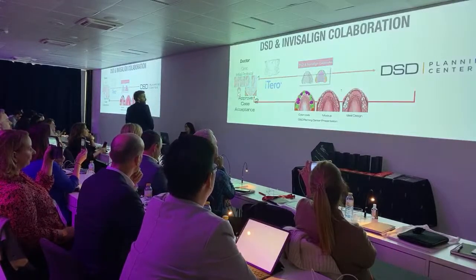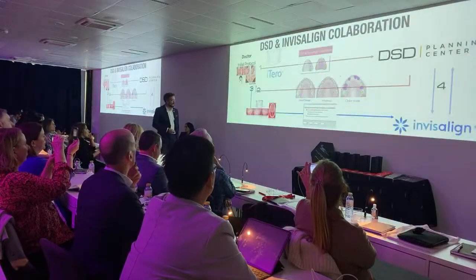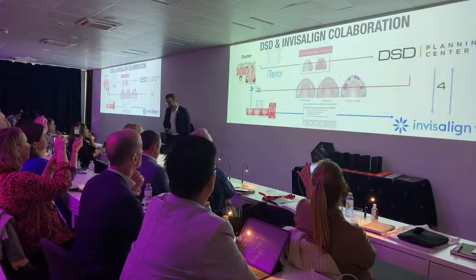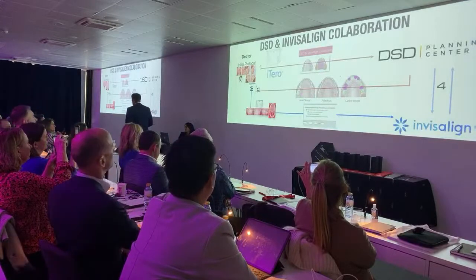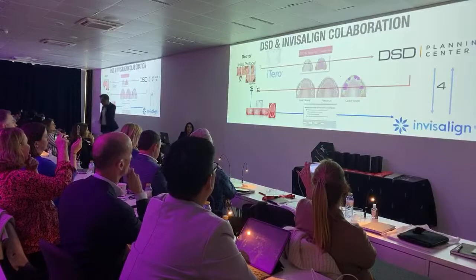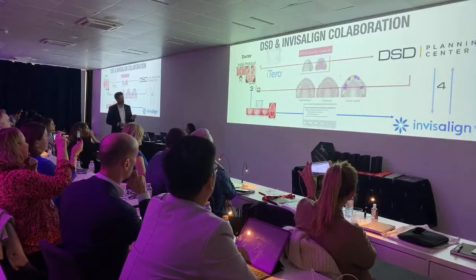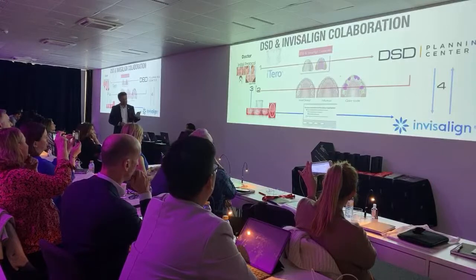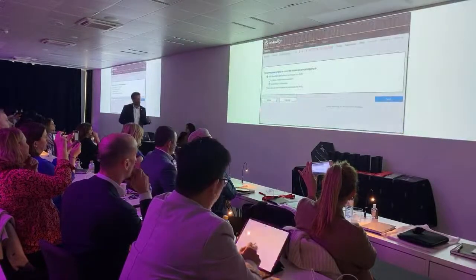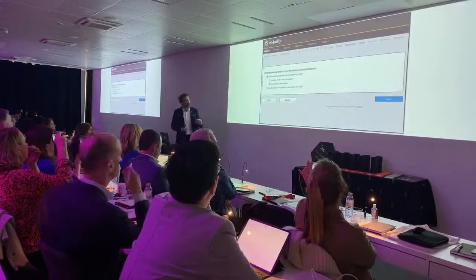So, whenever you approve, then you will submit the case to Invisalign, right? So that's the moment to really submit the case inside IDS. Okay? The same way, nothing changed. Of course, that's the mandatory step. Everybody that already sent a case knows what I'm talking about.